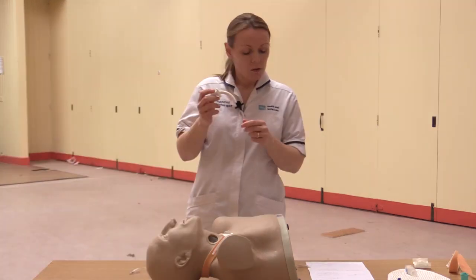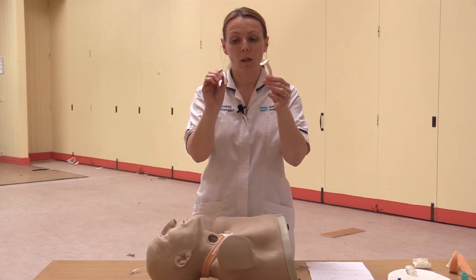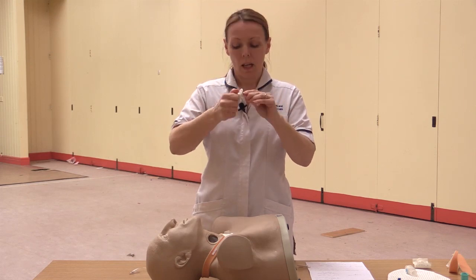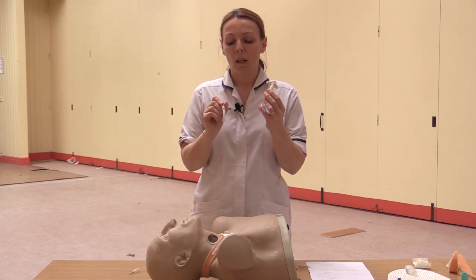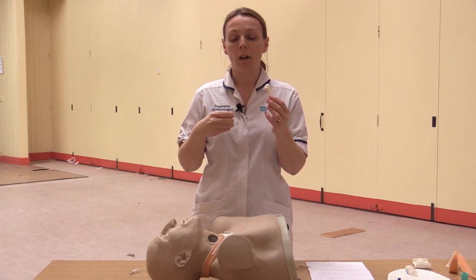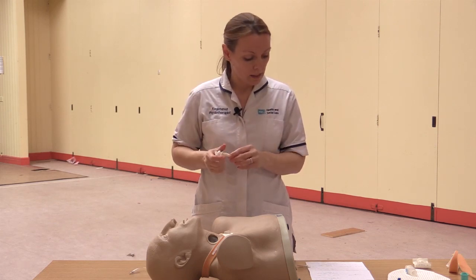Okay. So if you're going to suction somebody, you should be using an unfenestrated tube, so a tube that doesn't have a hole in it. Any of the fenestrated tubes are to allow speech, and they will allow air up through the vocal cords, and then it will allow some element of speech before they're completely decannulated.